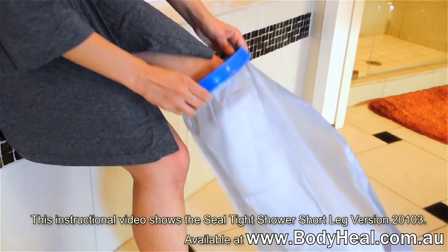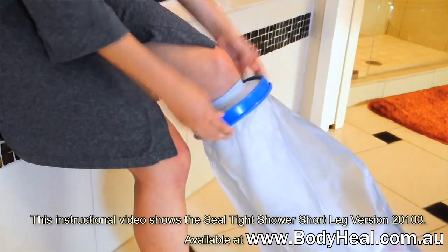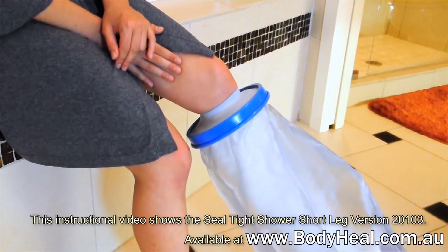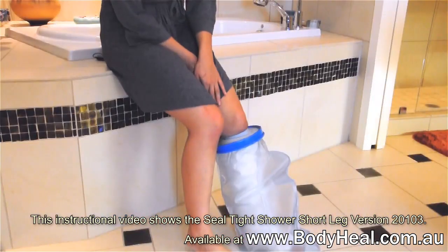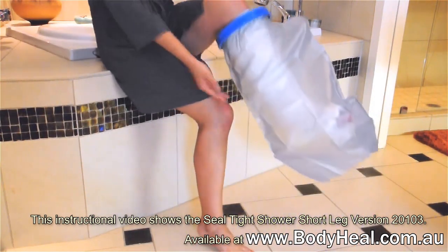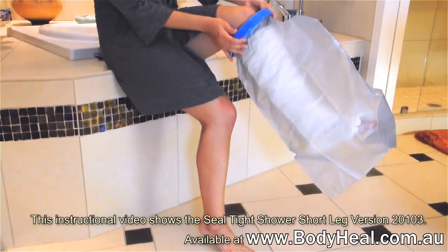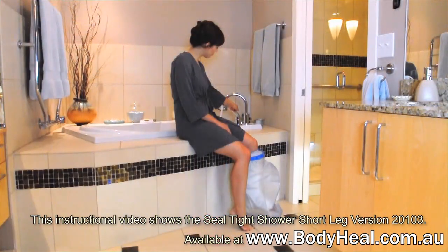To ensure a watertight seal, pull the diaphragm up, then back down, causing the edge to flare upward. The seal should be tight — after all, it's keeping water off of your cast. Never trim with scissors or puncture. It's also okay if the bag appears oversized, as this just allows room for large casts and easy movement.